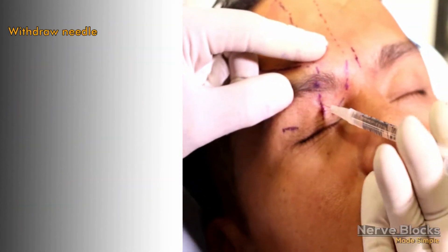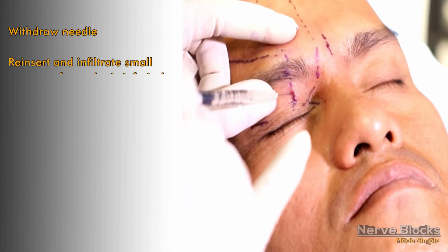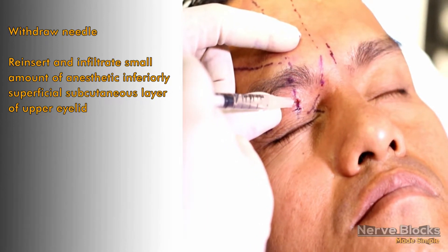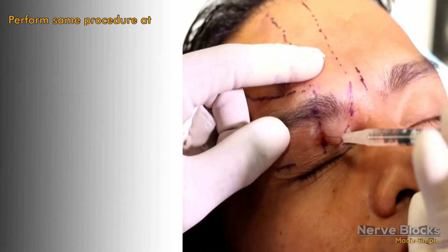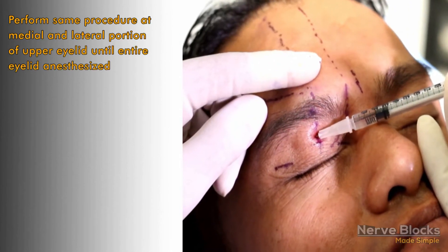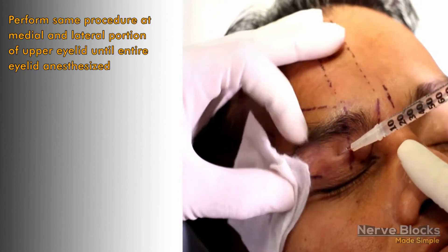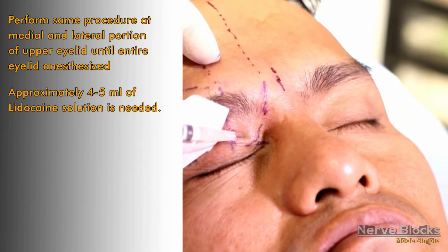Withdraw the needle, then reinsert and infiltrate a small amount of anesthetic inferiorly in the superficial subcutaneous layer of the upper eyelid. Perform the same procedure at the medial and lateral portion of the upper eyelid until the entire eyelid is anesthetized. Approximately 4 to 5 ml of lidocaine solution is needed.